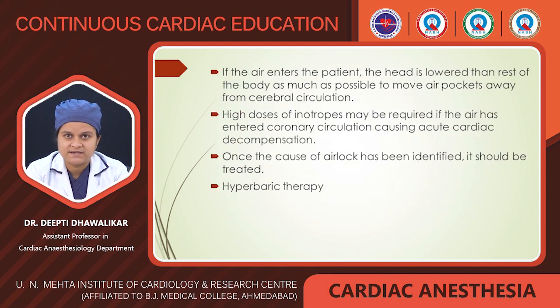If the air enters the patient, then the head is lowered than the rest of the body as much as possible to move the air pockets away from the cerebral circulation. Higher doses of inotropes may be required if the air has entered the coronary circulation because it will cause acute cardiac decompensation. Once the cause of airlock has been identified, it should be corrected accordingly, and hyperbaric therapy, if available, should be considered.